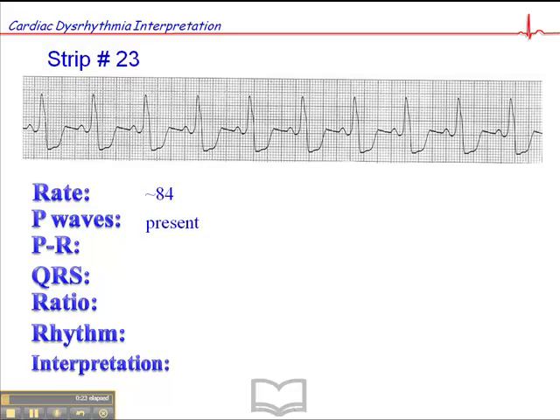P-waves are definitely present and consistent in morphology, and they're regular. The PR interval is about 0.16 second, and you'll notice that the PR interval is consistent throughout.